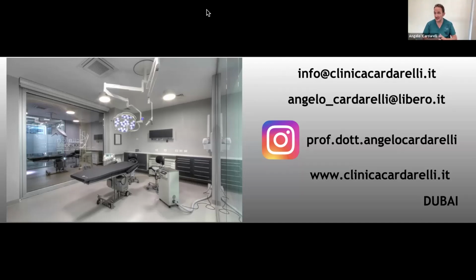The important thing, as you know, in the digital impression, sometimes with the edentulous patient, is that it's not easy. That's why before the extraction, you need to take the impression of all the palatal area, also the tuberosity. Then with the scan body, we need to do the same, starting, for example, from the tuberosity, so the program can match the previous impression with the second impression.